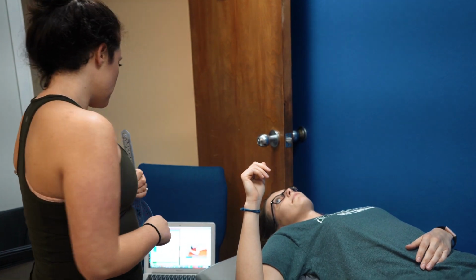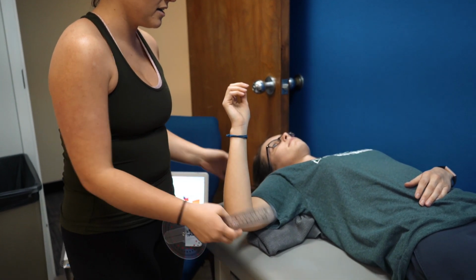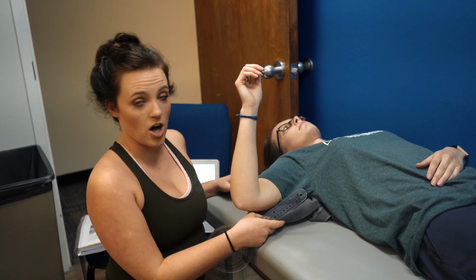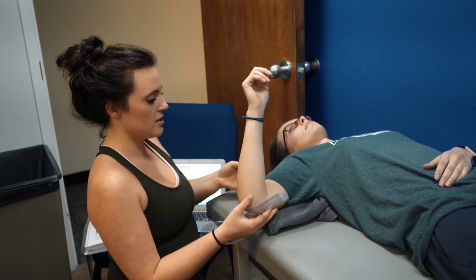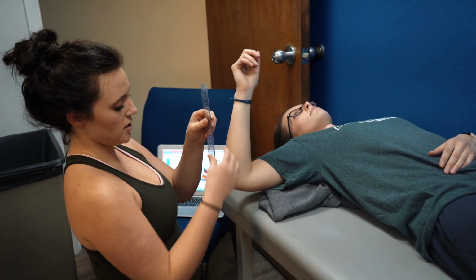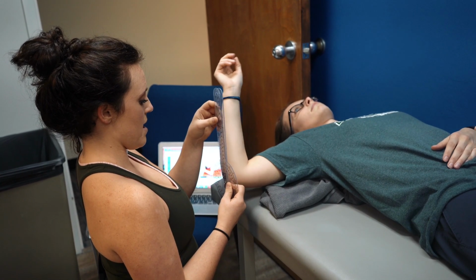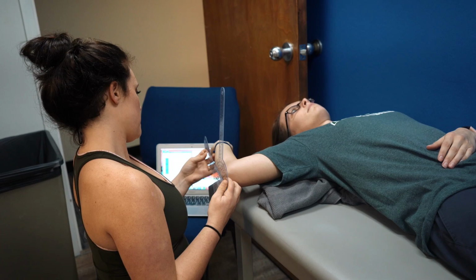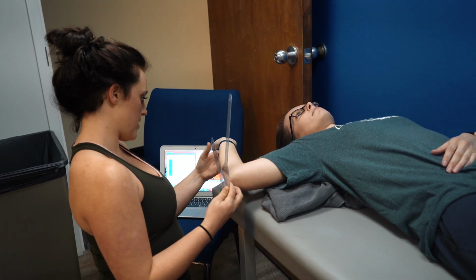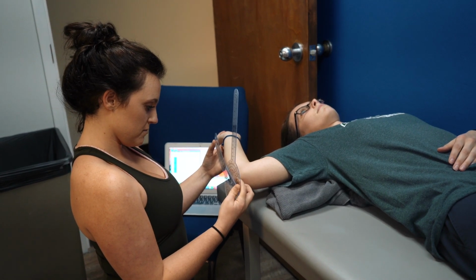Okay, we are doing shoulder lateral external rotation. So we're going to have Kennedy lay down supine. We're going to stabilize her shoulder by putting some kind of cloth or towel under her shoulder. So we're going to start her out in this position, and we're going to align the fulcrum with her elbow. And so we're going to have her go ahead and go back. And the moving arm, we're going to line up with the ulnar side of her wrist. So she is at 75 degrees.